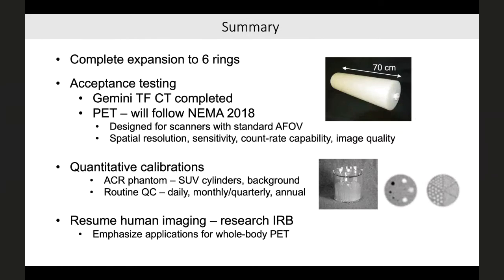I just wanted to say that it's exciting anytime that you can have something that maintains resolution or actually improves it and is shorter. It gives you more flexibility for your clinical protocols, where obviously target organ exposure is a limiting factor on how many scans you can do within a participant within a unit of time, like a year. And so for repeated measure designs, being able to have this increased sensitivity, it's extraordinary to be able to have short scans. In addition, of course, on top of that is being able to see brain and body at the same time. Right. So for the neuroinflammatory protocols, with Bob's neuroinflammation tracer, being able to look with the HIV OUD protocol eventually, and with Reagan's OUD and lung, it just opens extraordinary opportunities. I'm sure Dave will talk more about that. Yeah.